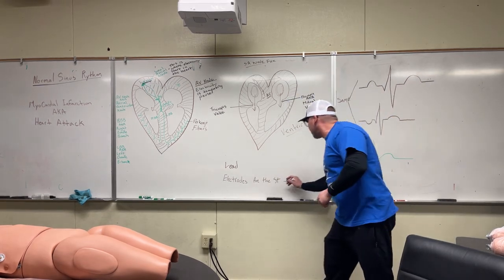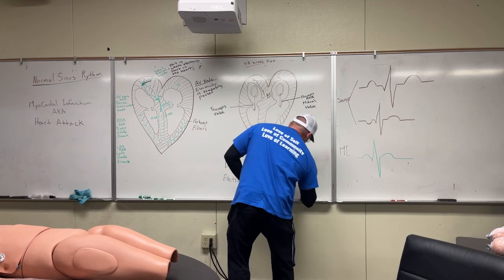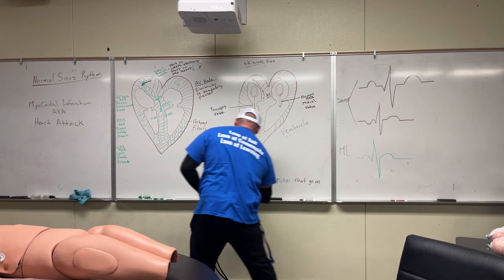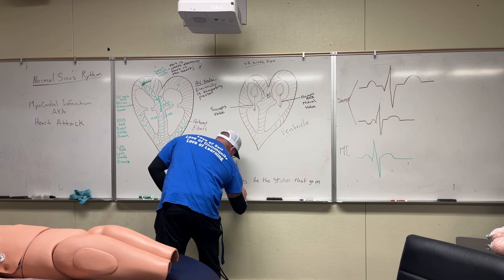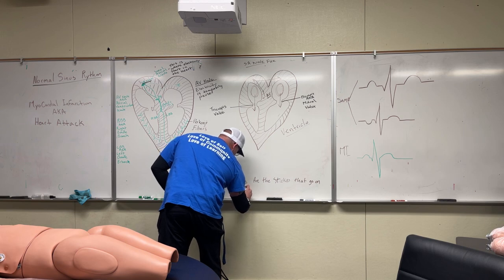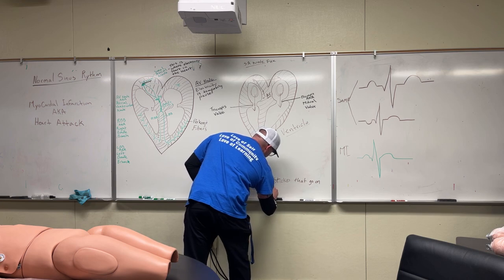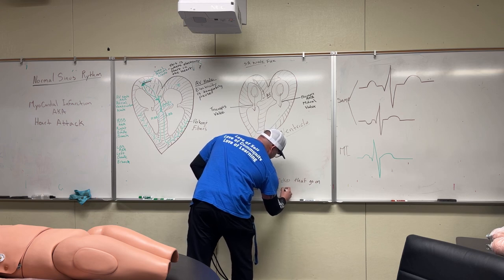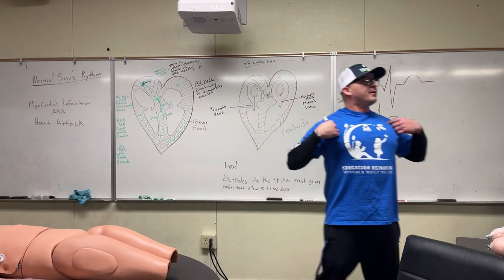So electrodes are the stickies that go on the patient that allow us to see the EKG. Okay, and it'll make more sense after the video pops up.